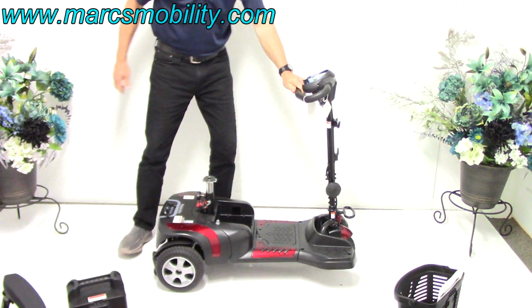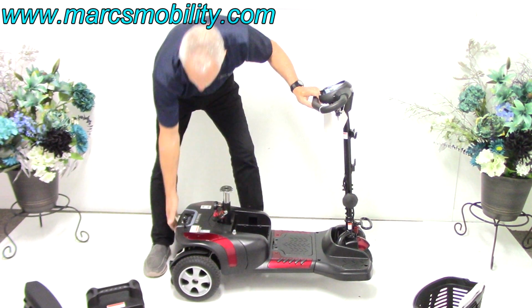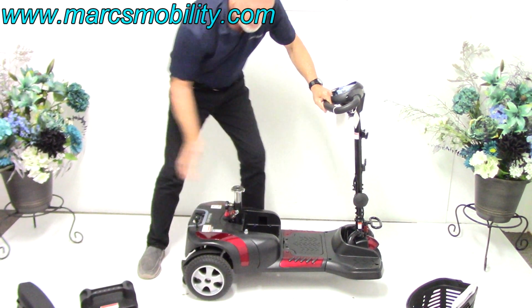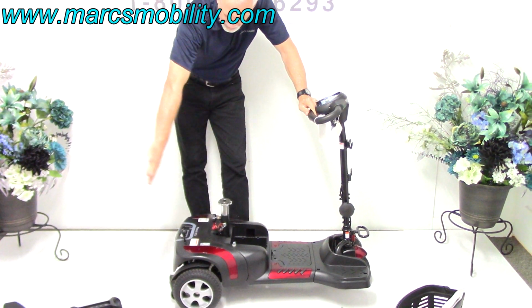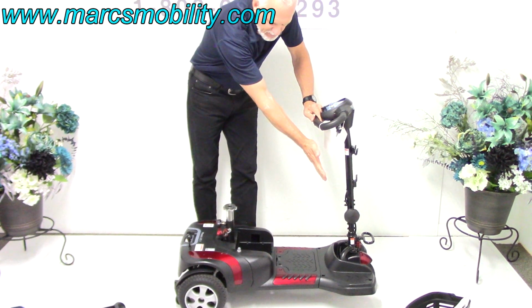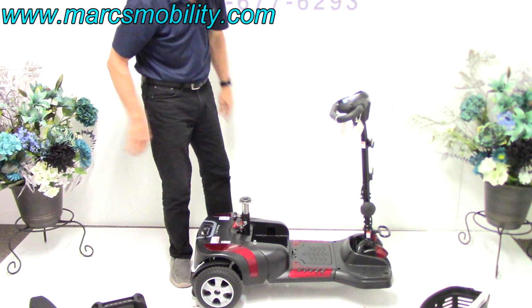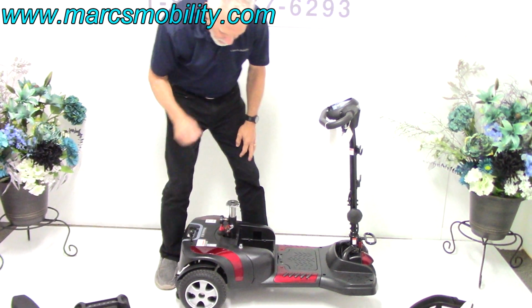So you can also do it if you have a strong person with you. You could grab the back and the front and put it in one piece if you didn't want to split it. But if you split it, you got about 35 pounds, 33 pounds, and roughly between the two is 66 pounds, okay? That's if you take it apart. If you don't take it apart, then it's different.